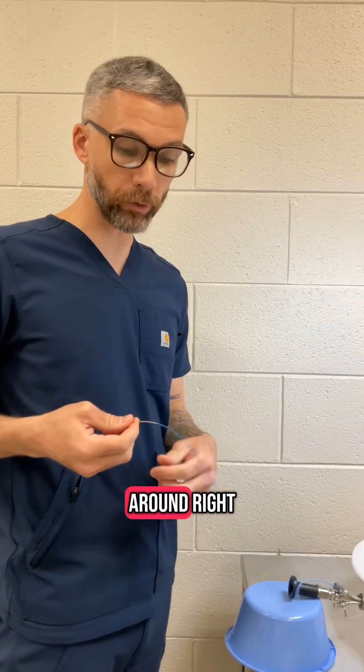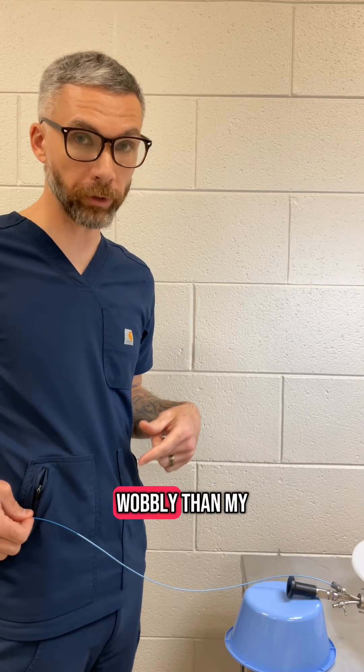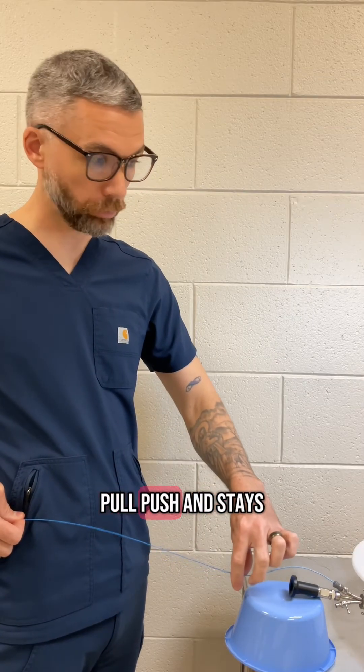Hold it like a tightrope. What I would typically do is hold it not free in the air, because your hand will move around. Hold it up against my body so I'm more likely to stand still and less wobbly than with my hand free in the air. Every time they're pulling on it, when they pull, push — that stays.